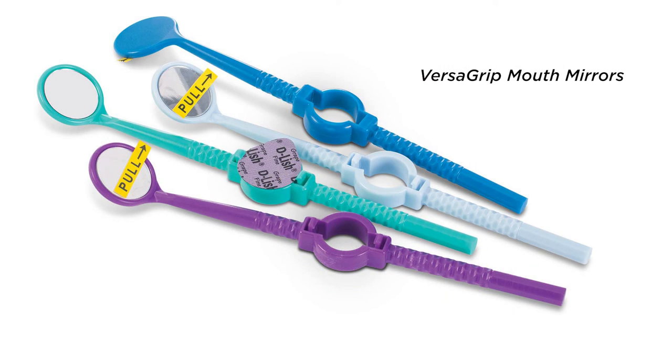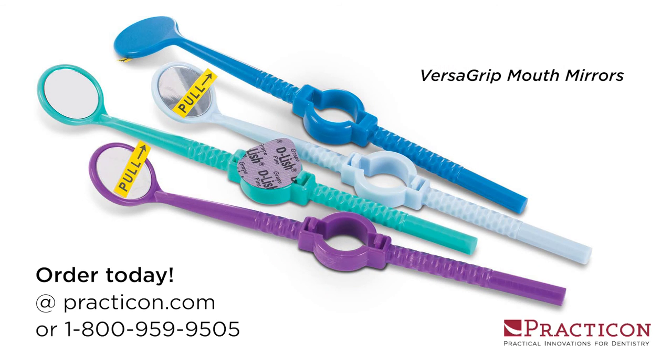The lightweight, disposable mouth mirror that secures any profi paste cup at your fingertips. That's Versagrip mouth mirrors — another practical innovation from Practicon.